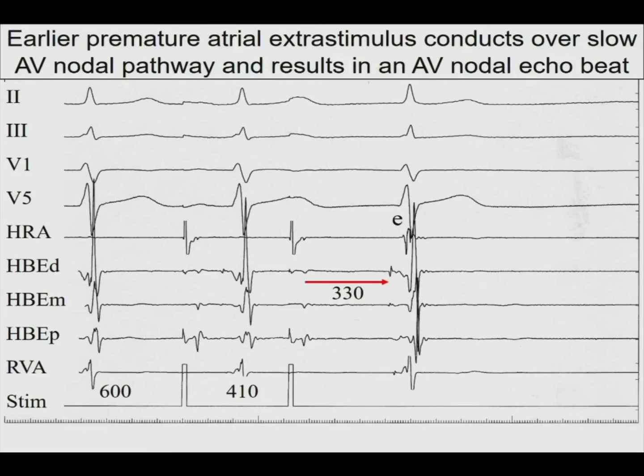How do you know that? Yeah, so when we talk about atrial and ventricular depolarizations, it's really important to look at the electrograms on each catheter at baseline, so you really know what's being shown, so that when you see tachycardia, you can differentiate these. That's one point.